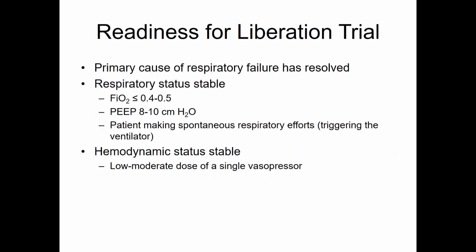So there are some basic criteria that we use to assess whether a patient is potentially ready for liberation. The first thing, of course, is that the primary cause of respiratory failure has resolved or is at least resolving. And that's really a clinical judgment that you make based on the overall course of the patient in terms of their gas exchange, their hemodynamics, their level of consciousness. Really depends, of course, on why they were intubated and put on a ventilator in the first place. But your general sense as the bedside clinician is that the patient's getting better.